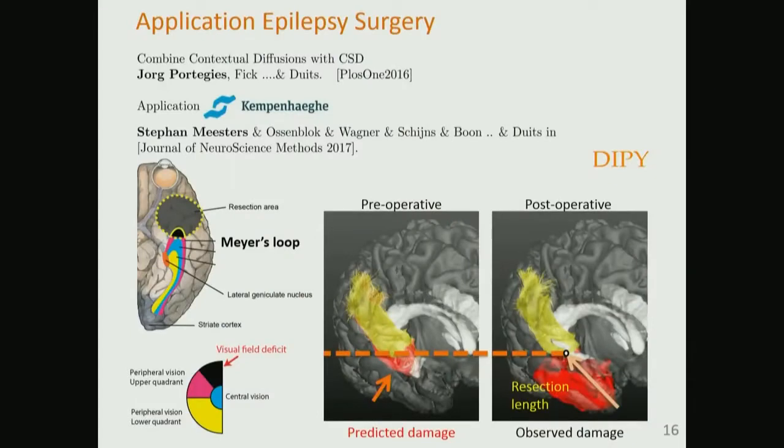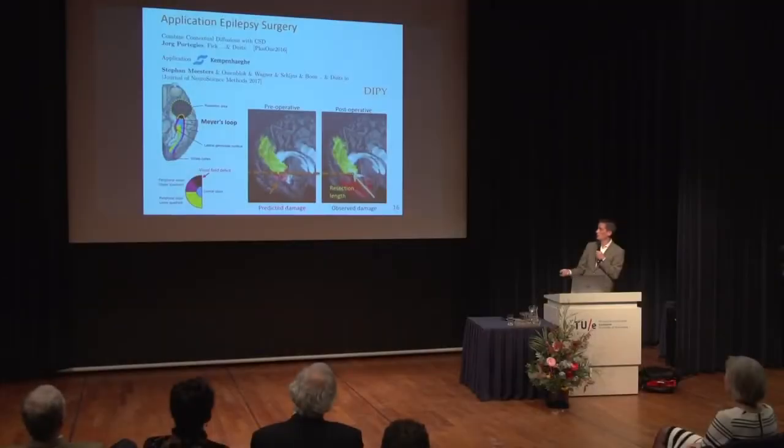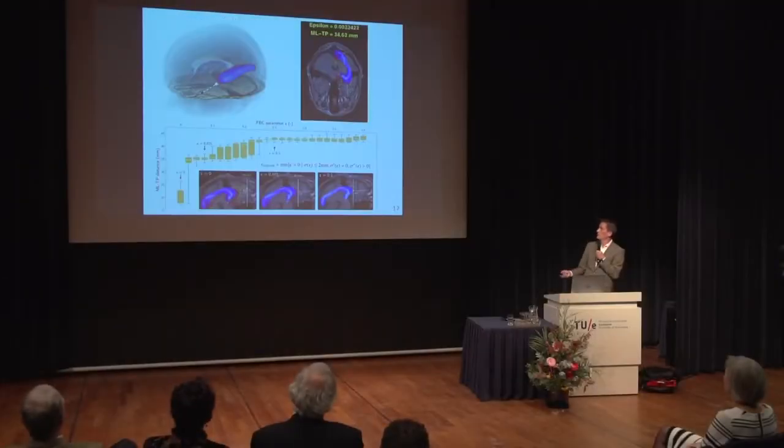And then, thanks to our methods, we can compute these optic radiation fibers in a stable manner, in a reproducible manner, following a retest procedure. And we verified our methods on pre- and post-operative data. Okay, I'll skip this slide.